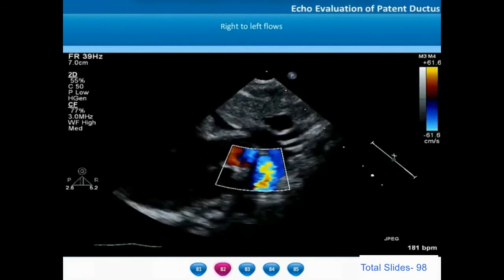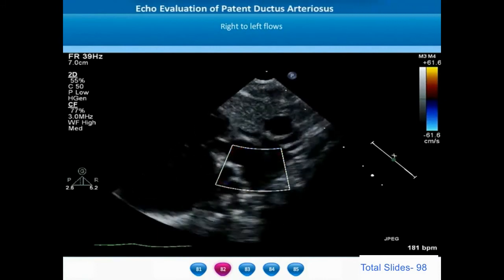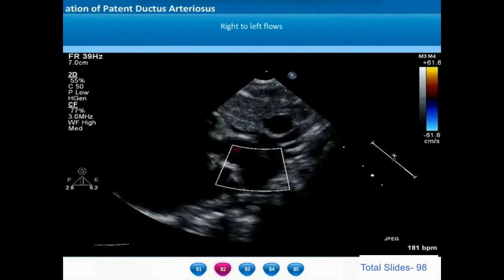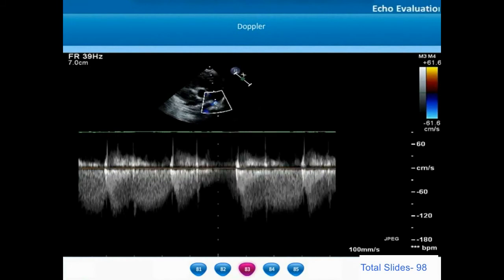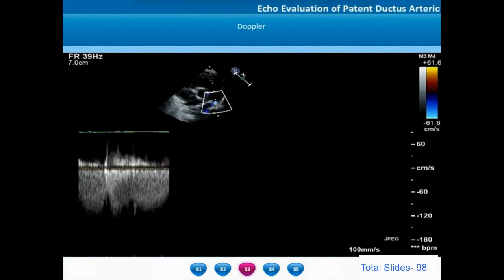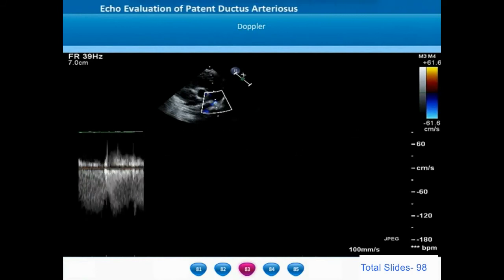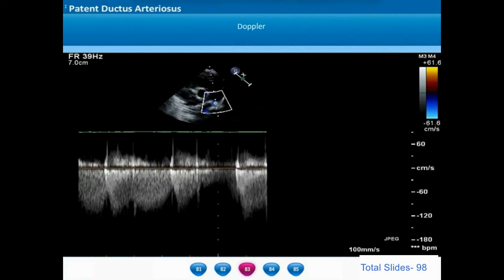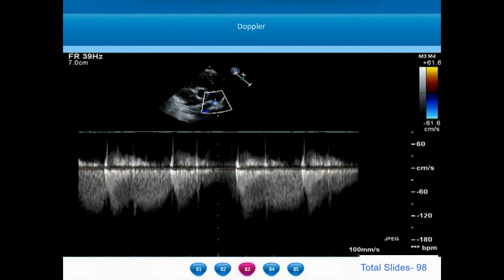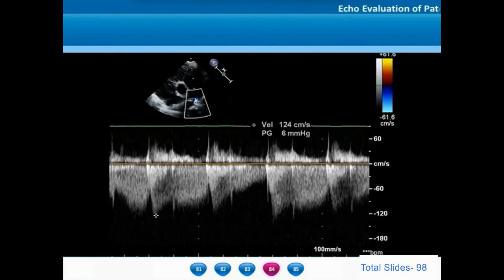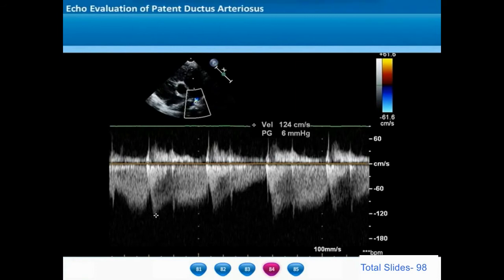From the suprasternal ductal view, once again we notice complete flow reversal — blood flows from the main pulmonary artery through the ductus into the descending thoracic aorta. When we interrogate the continuous wave Doppler signal through the ductus arteriosus, the entire flow is right-to-left, with the spectral Doppler signal clearly seen below the baseline — indicative of flow from the main pulmonary artery through the ductus into the descending thoracic aorta. The flow across the ductus is totally right-to-left with no left-right flow — a feature of a truly hypertensive patent ductus arteriosus.